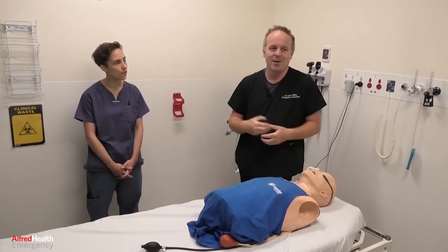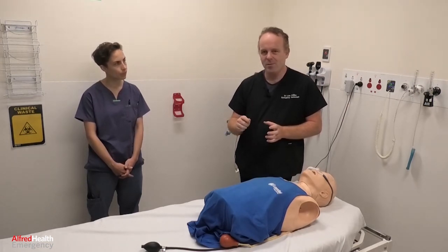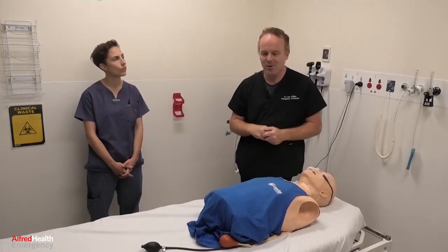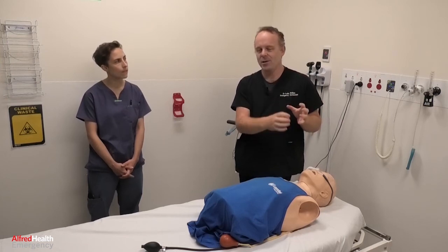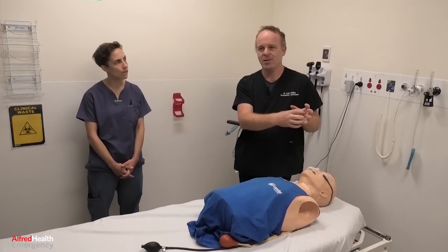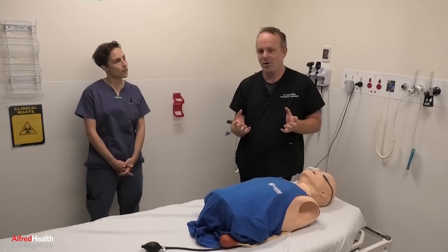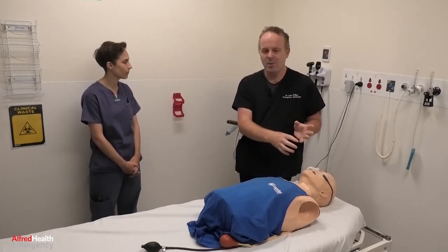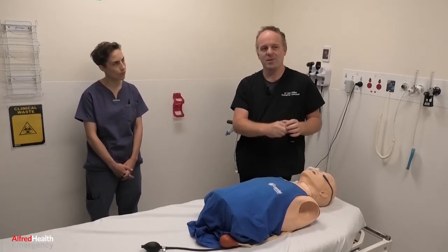The next critical moment is after you've intubated the patient: the cuff needs to be up, and the bougie can come out just slowly, not flicking around in the air, which is one thing we've noticed. Then a filter is attached to the inline suction attached to the top, and then a filter is attached to that. It can either be connected to a bag valve mask with end tidal or directly to the ventilator. If you are going to change from a bag valve mask and ETT, then you need to clamp the tube to stop an open circuit.